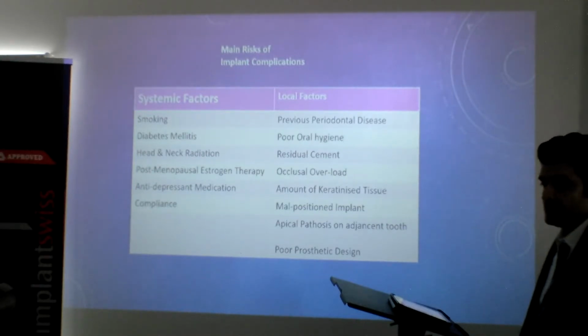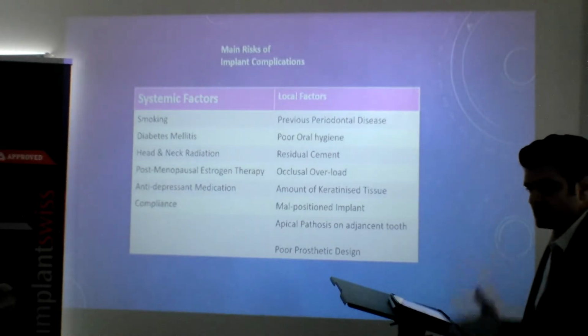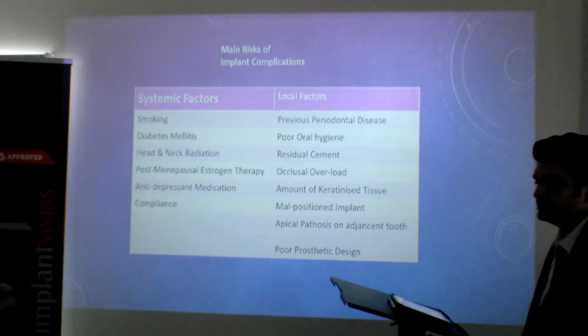That will define where you're going to be placing the incisions as well, right? According to the area, of course. Yes, from the aesthetical area. We have to have margins. We talked about keratinized mucosa and non-keratinized. So which one is fair? Depends. Keratinized, it's better, mostly. And the incisions, what would be the placement? Would it be on the alveolar ridge, on the crest, or lingual or palatal? I would say it should be slightly towards the middle, to cover the implant. You don't want the implant surface to be exposed. Everybody agree with that? Yes.